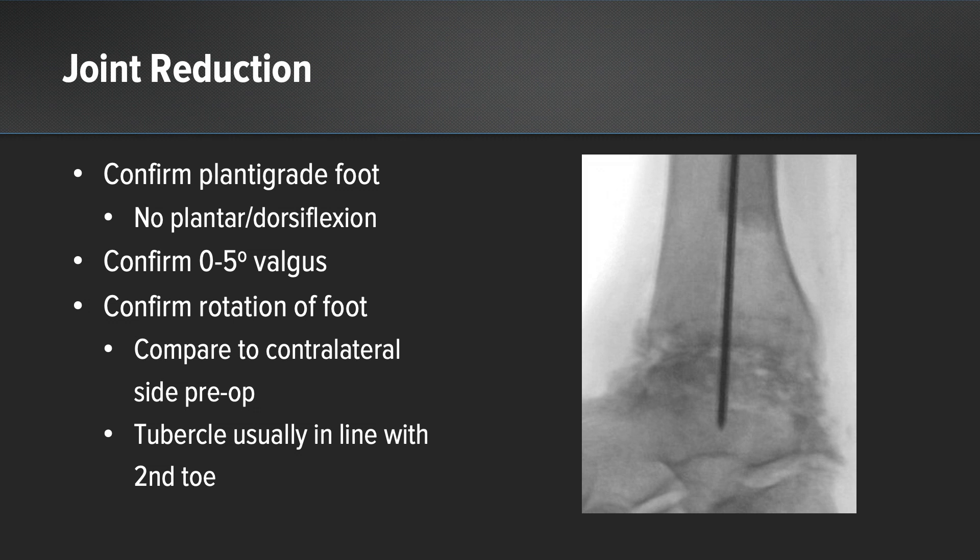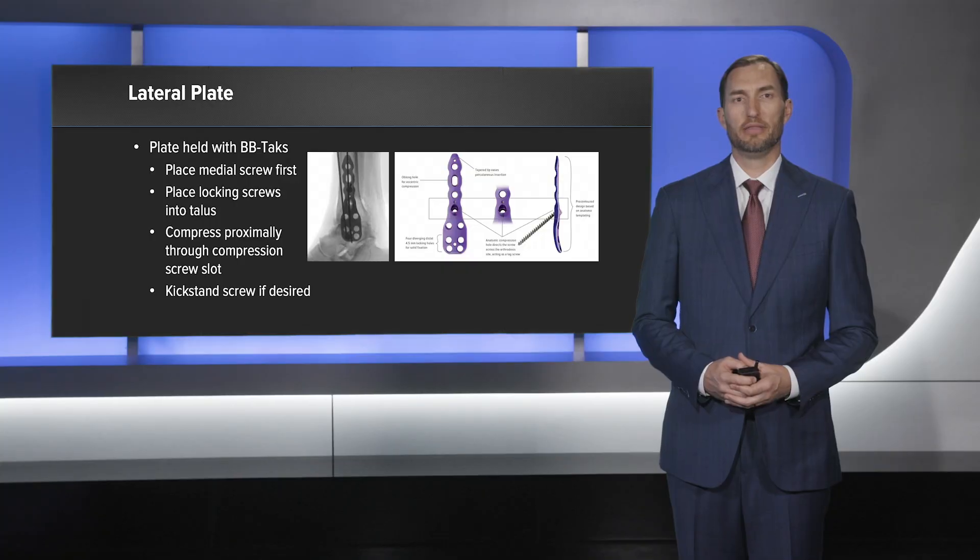Then I confirmed my rotation of the foot and compared to what I had seen preoperatively with the contralateral foot. I typically align the second toe with the tibial tubercle. Then the plate is placed and held in position with BB tacks.